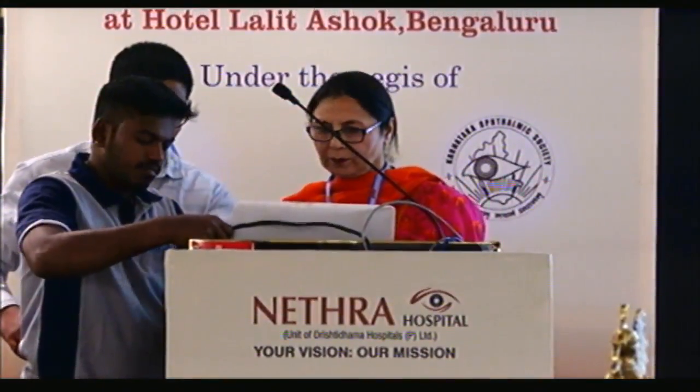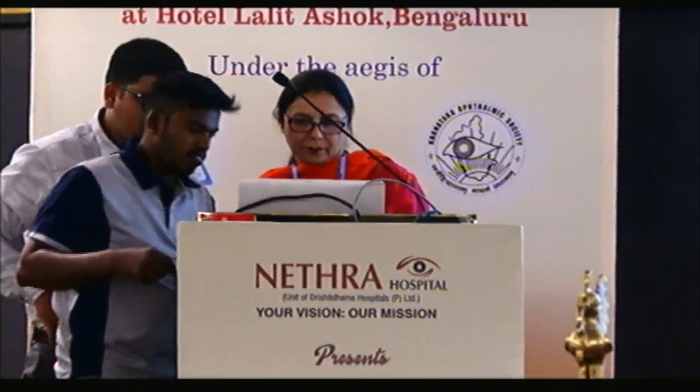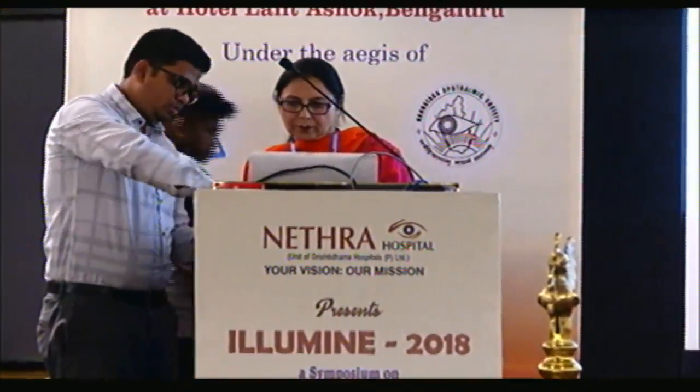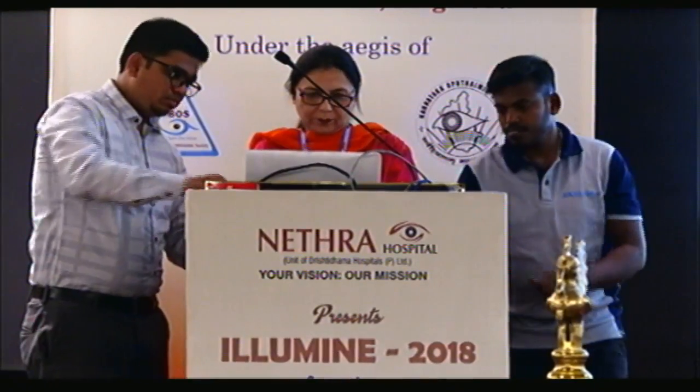If you notice the same patient after 2 months, in this place and then another finding here, the area has become much longer, with hyperreflective dots magnified over here. Longer doesn't mean it's doing well, it means it's getting worse. And over a period of time, even the SRF has come down. So that's one.